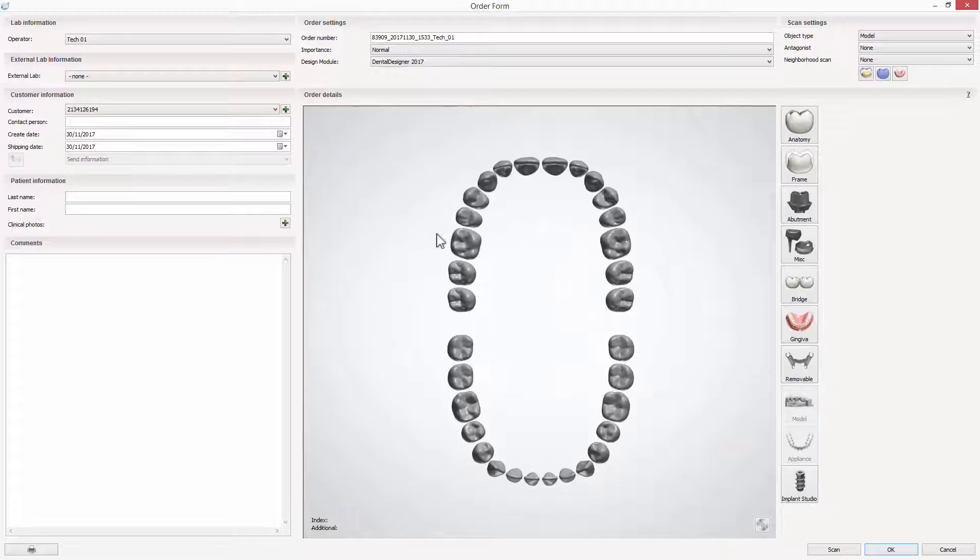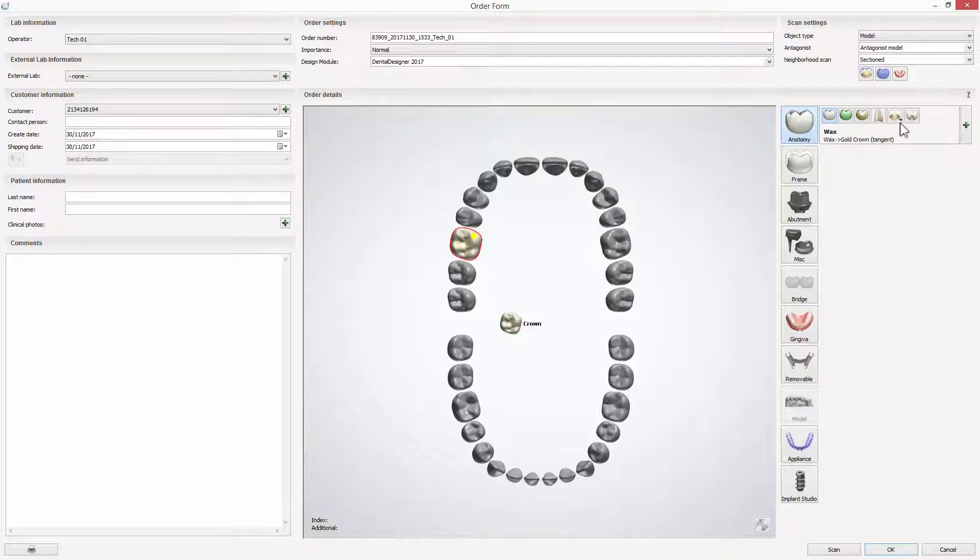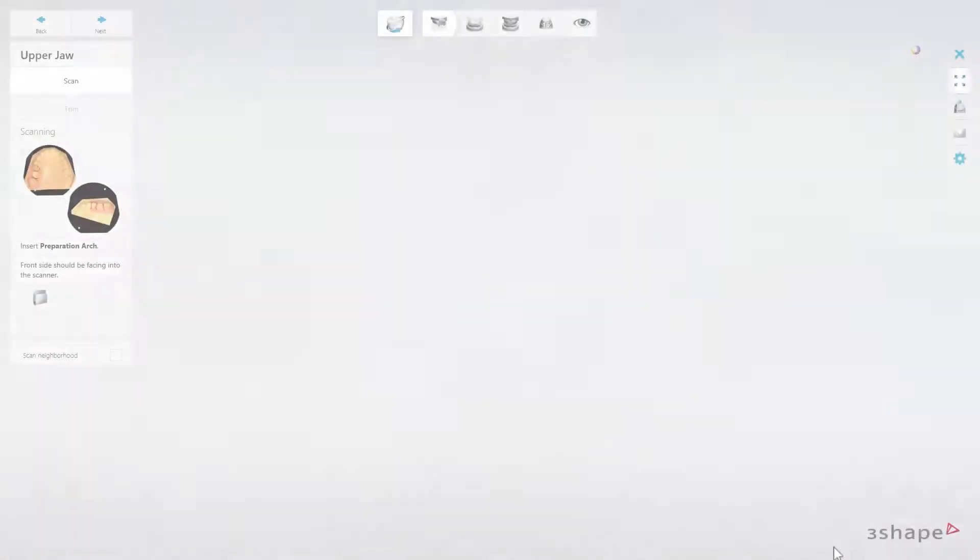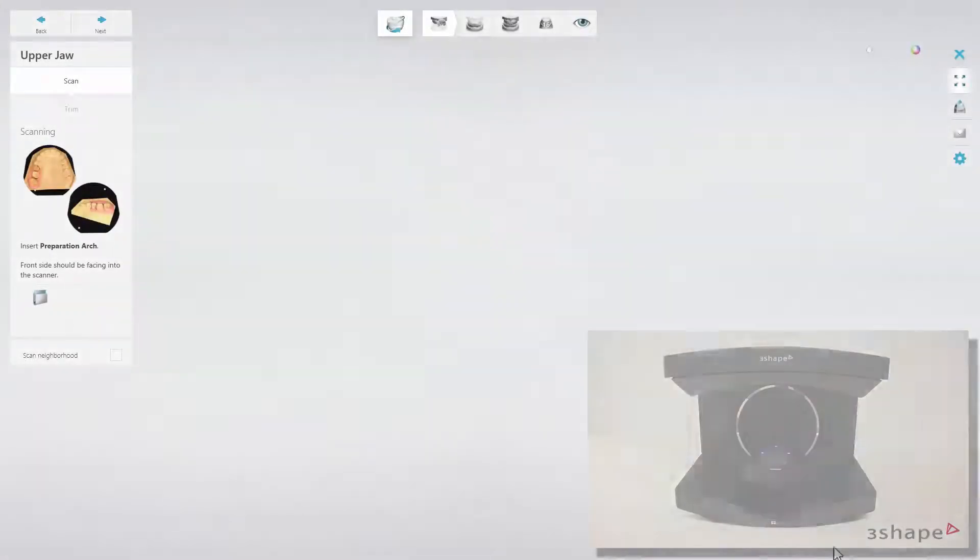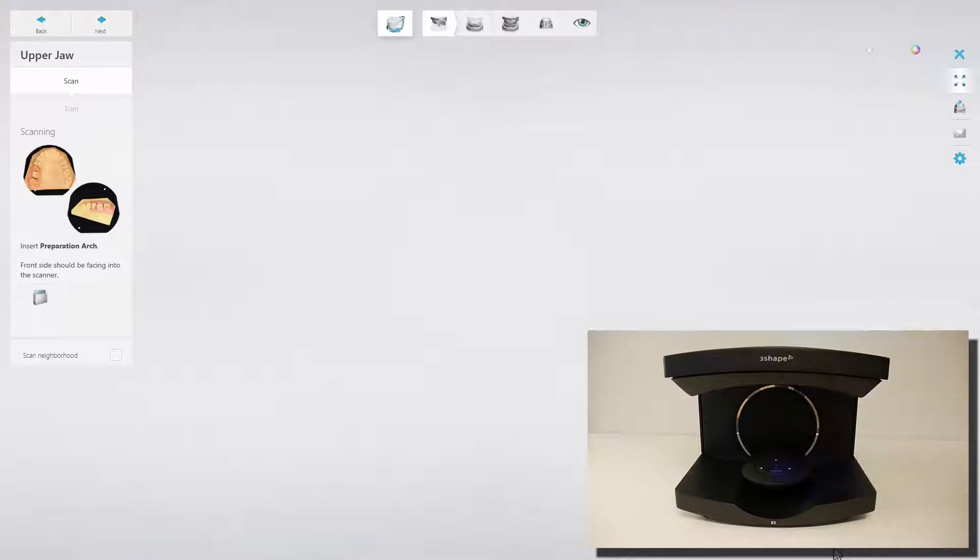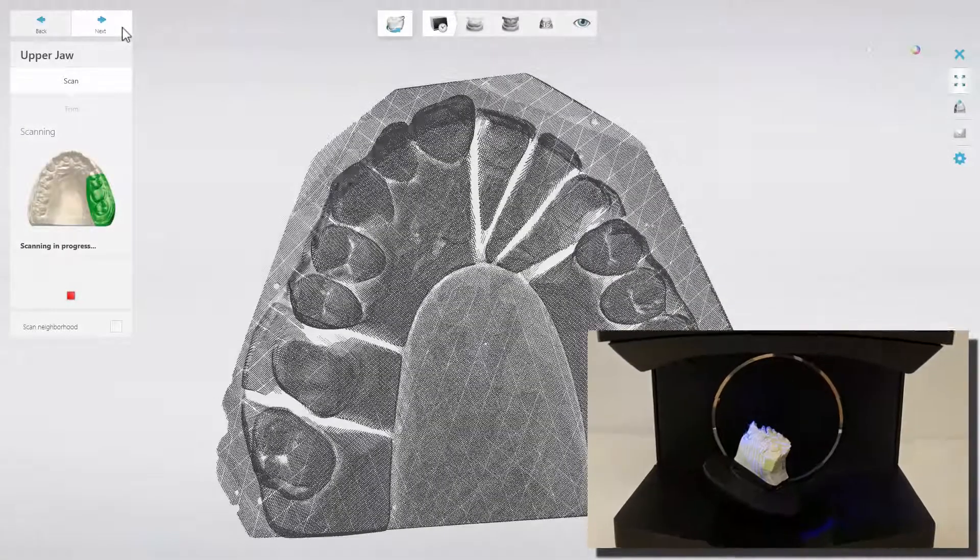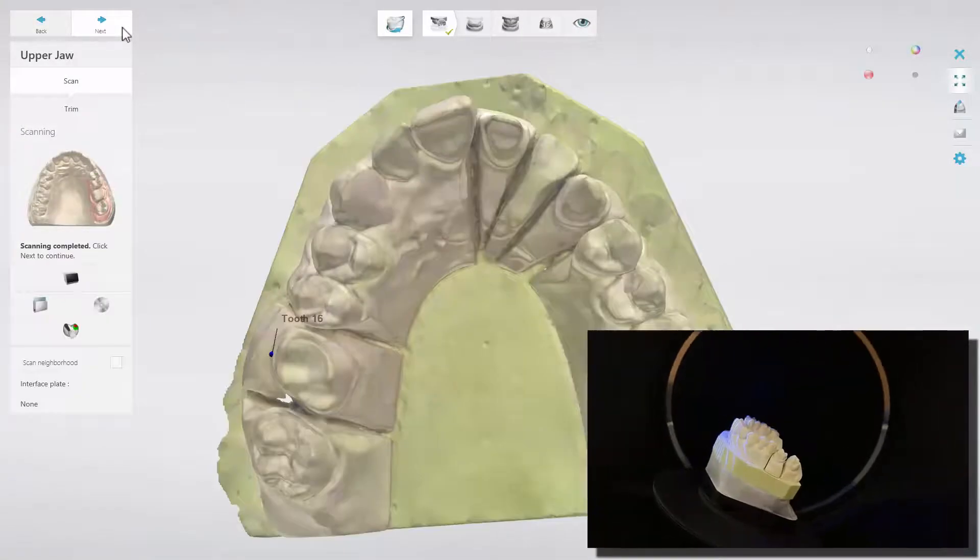You should start the workflow as usual by creating an order form for the required restoration. When scanning the models that have been fixed into the Articulator, there is no need to use the Scan Height Adapter. Scan the upper and lower model in the usual way.